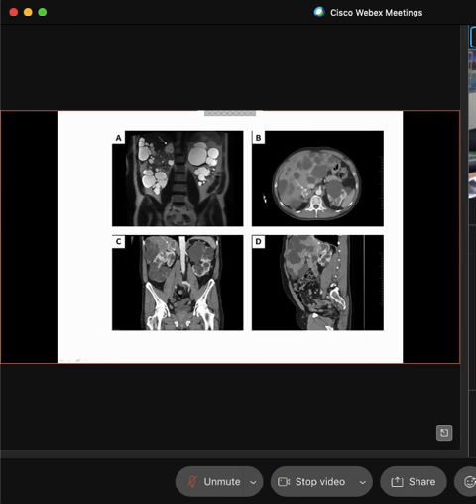The left. Right, so right side. Remember, you're looking at inferior to superior, just like we view a radiograph. If this is the patient's left, this is the patient's left. If this is the patient's right, this is the patient's right. This patient has just laid down recumbently.